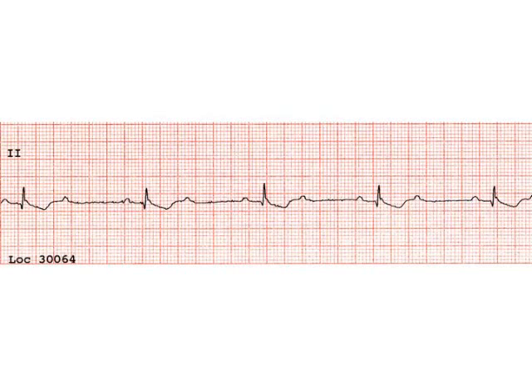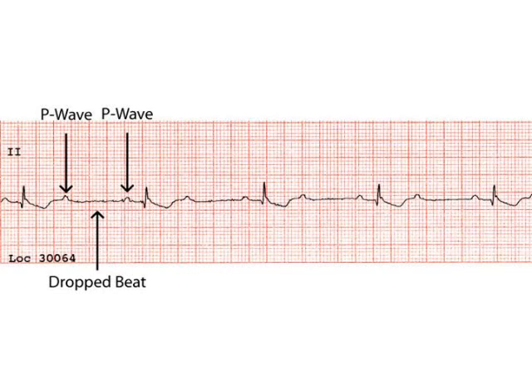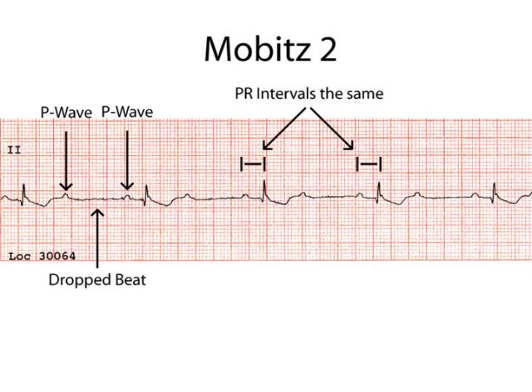Here is an example of an interesting rhythm. Students might want to hit the pause button, try to interpret the strip first, and then turn it back on. Looking at the first strip, starting on the left-hand side, I see a P wave, a QRS, a P wave. There are two P waves with a dropped beat in the middle: a P wave, QRS, inverted T wave, a P wave, and then another P wave. This would be an example of a heart block called a Mobitz II. The definition of a Mobitz II is that the PR intervals are always the same prior to a dropped beat.